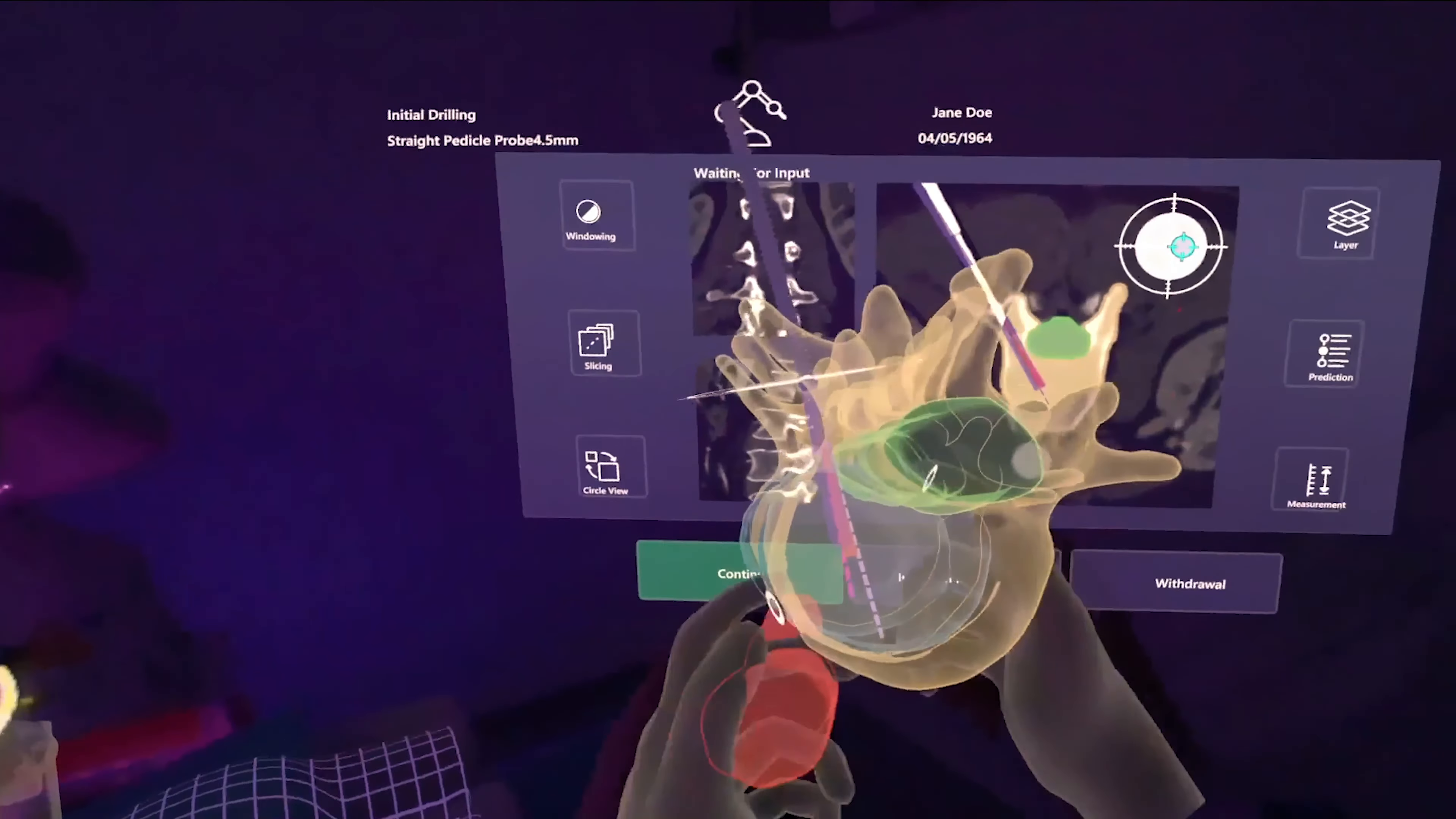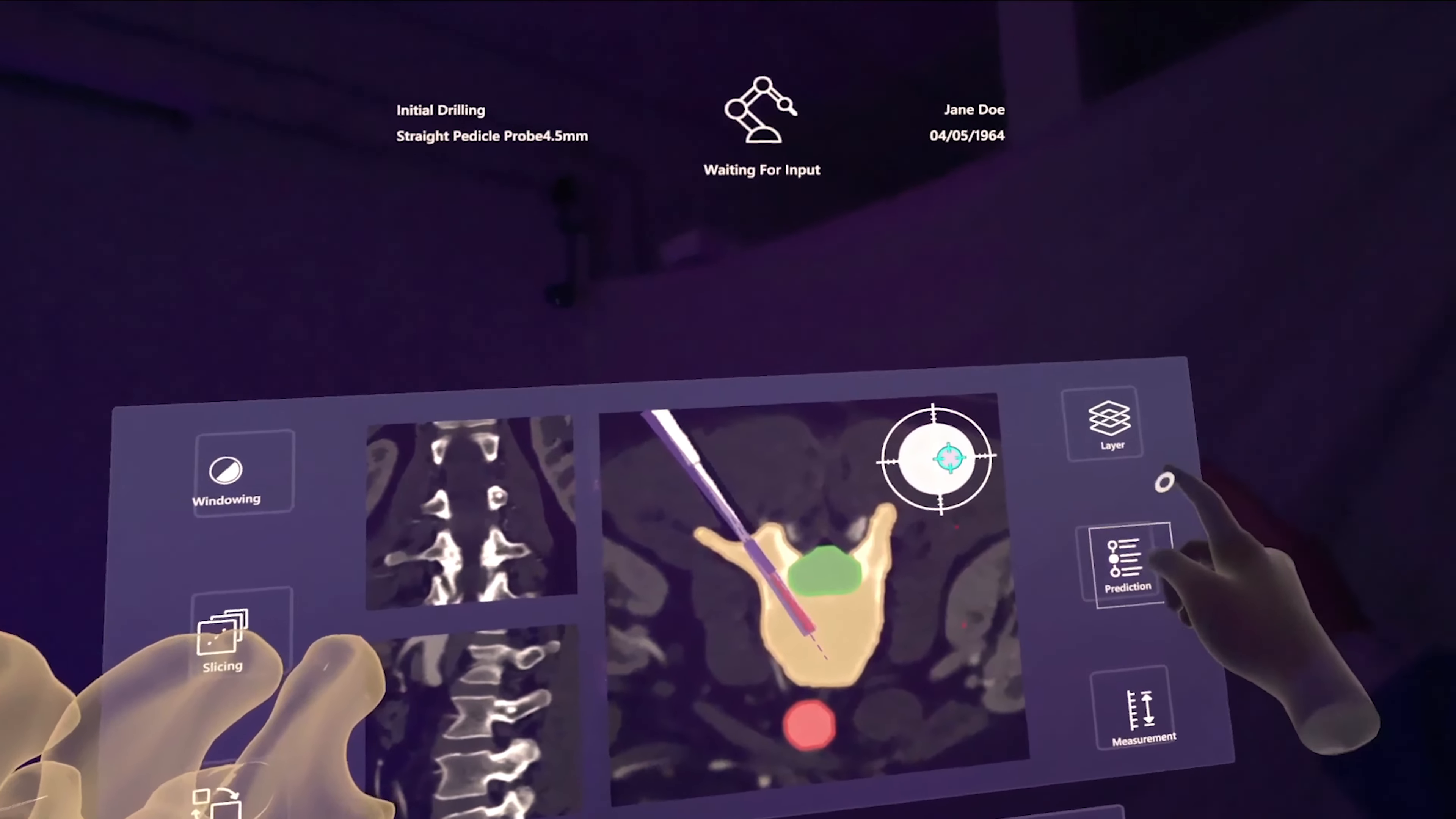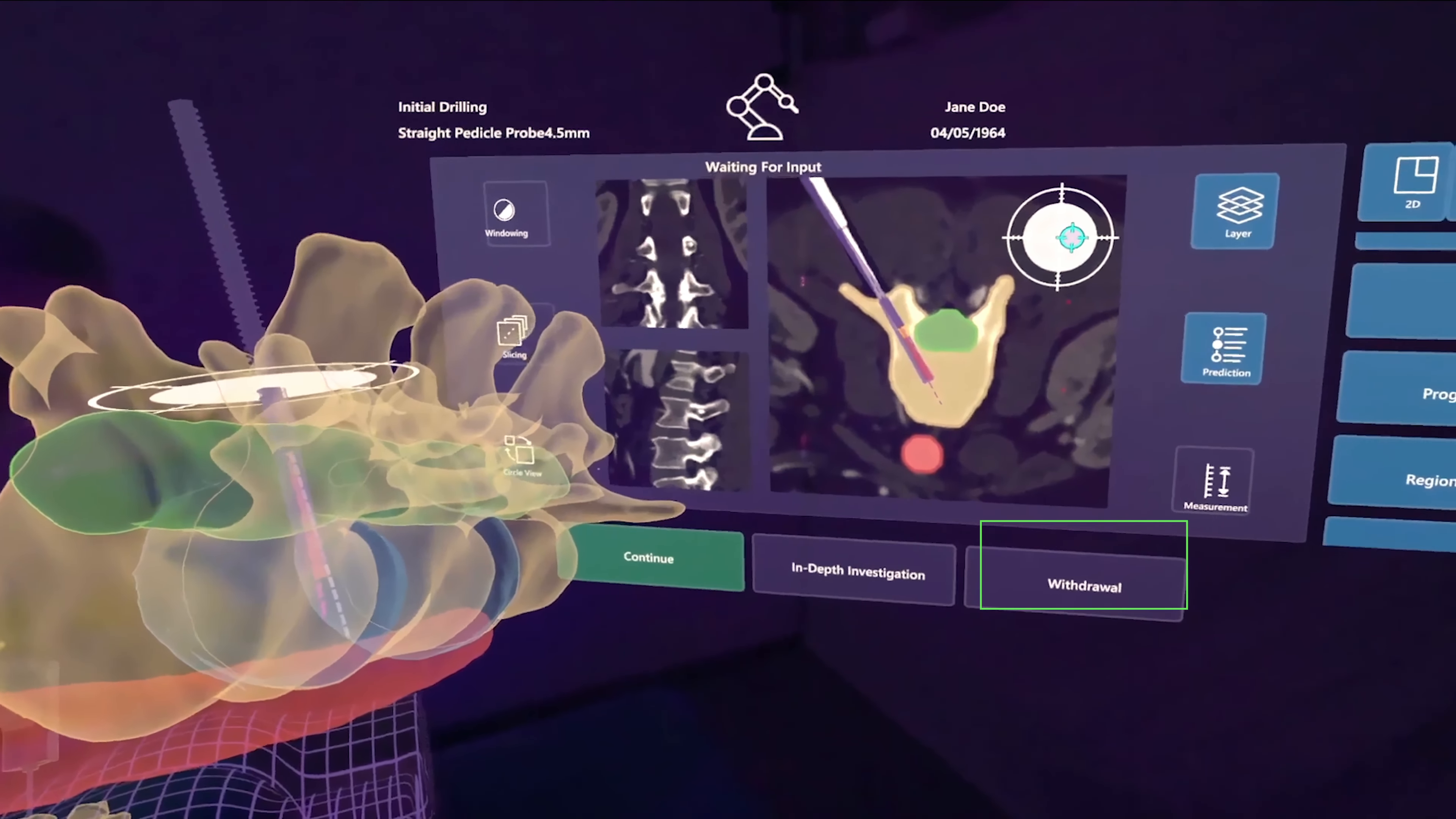This is highlighted in the 2D view with a red indicator, in the 3D view with an equivalent indicator and in both glyph visualizations. The surgeon can decide to continue despite the deviation, to adjust the required parameters, or to withdraw the robot completely.